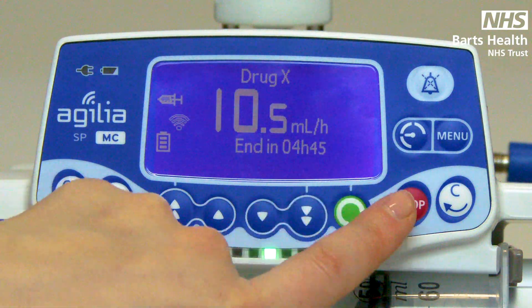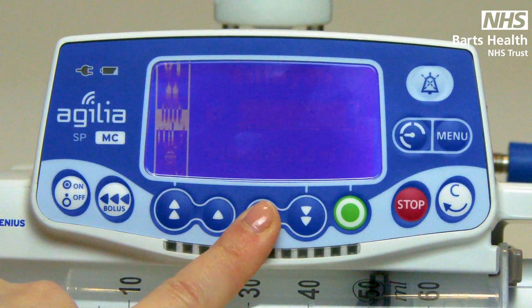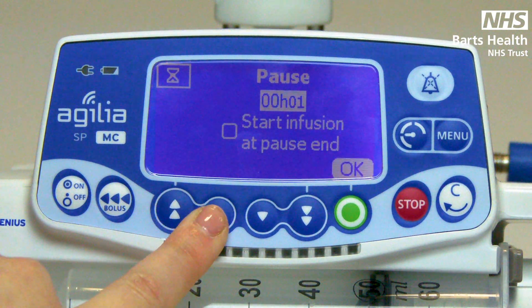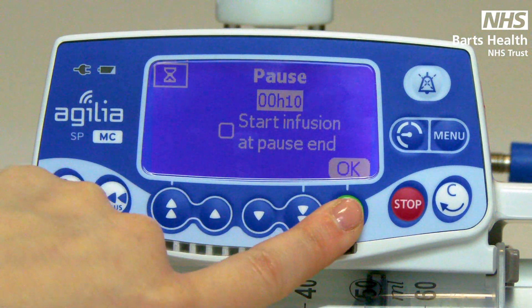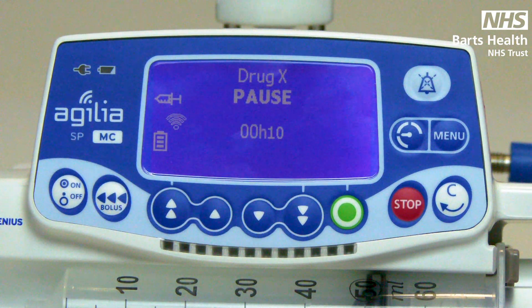Pressing the red key will stop the infusion, as indicated by no lights moving. If you are stopped for two minutes or longer, the pump will alarm. If you wish to avoid this, go to your menu, find your sound timer symbol and you can pause the pump. Use your double arrows to pause for hours or your single for minutes. Press confirm. You do not wish for the pump to start before you are back, so press green again. Now the pump is paused for ten minutes and will not alarm during this time.